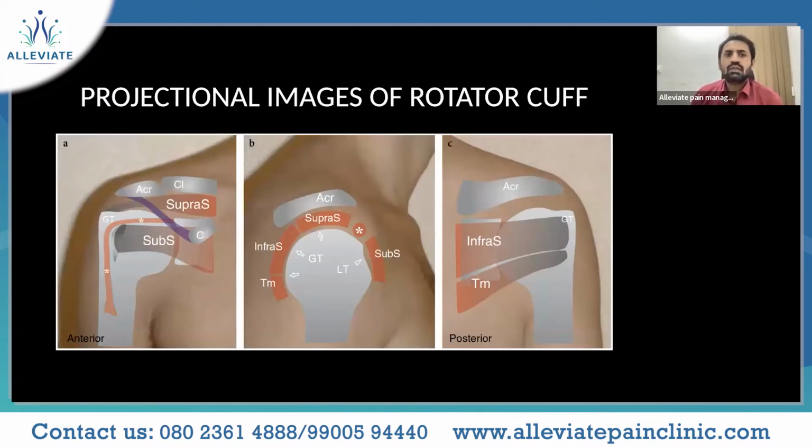So these are the projectional images of the rotator cuff, which are of prime importance for us. You can see an anterior view, you can see a sagittal, coronal, sagittal, and how anteriorly and posteriorly the rotator cuffs will be seen.